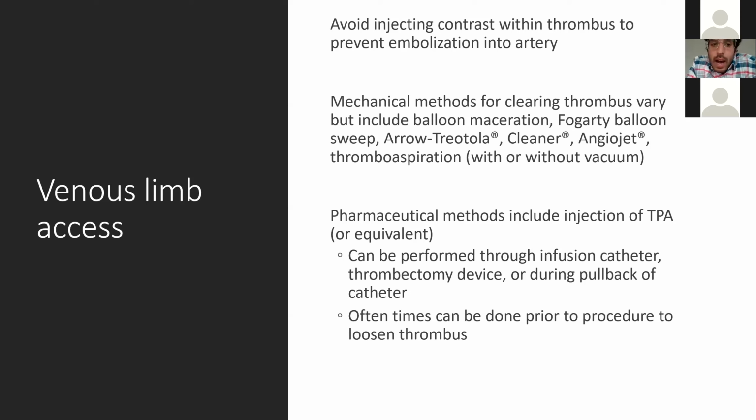So, I think the second point is that there's a lot of mechanical methods for clearing thrombus, and it can be as simple as just ballooning everything and sweeping it with a balloon or a Fogarty.